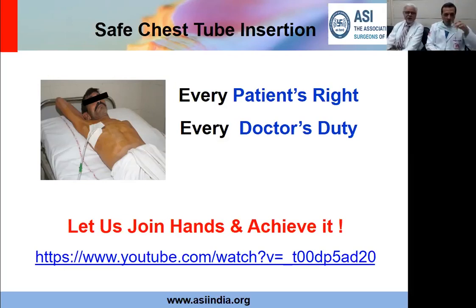So, tube blocks. Anytime we put in tubes in surgery, we know that they can get blocked. So once that kind of situation happens in an intercostal drainage, which you mentioned would be known when the air column stops moving, and you have also mentioned what should be the post-operative regimen in this patient to avoid that complication. But if it were to occur, what would be the options for the doctor?